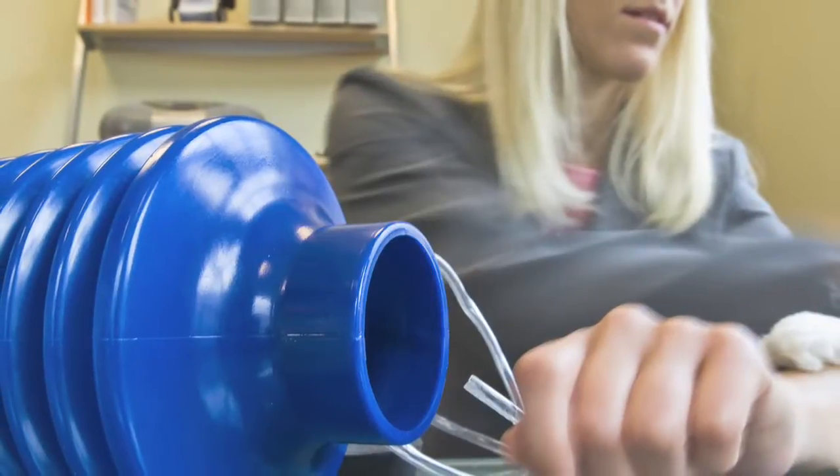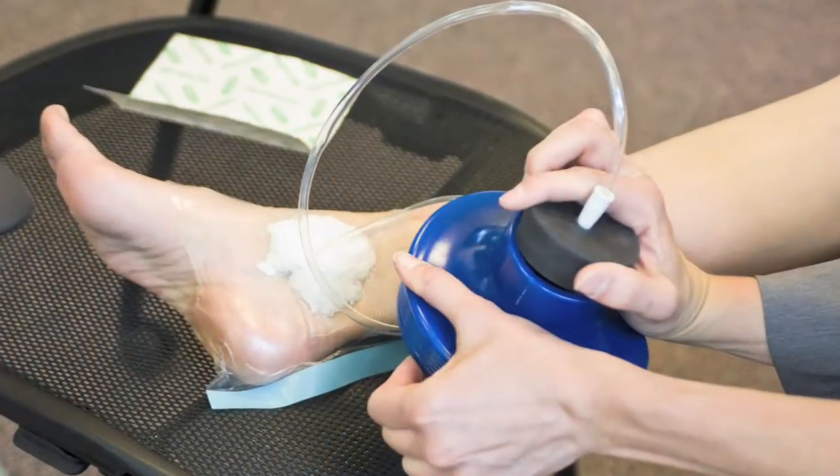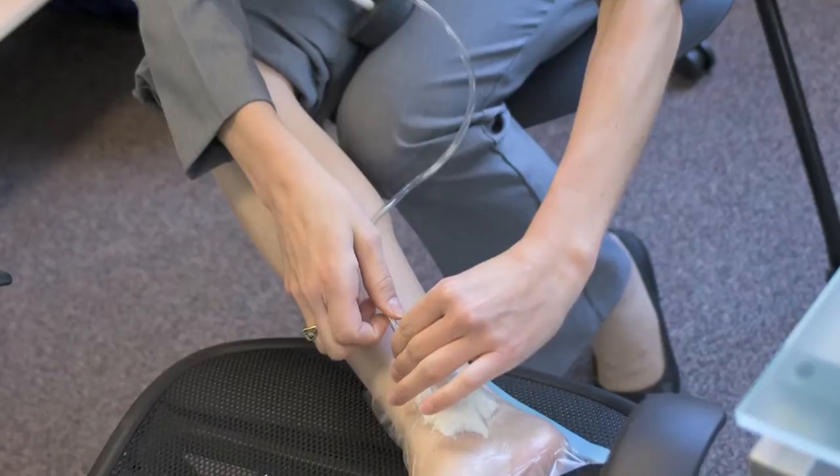I'm Danielle Zurochik, a PhD candidate in mechanical engineering at MIT, and I designed a simplified negative pressure wound therapy device for wounds in the third world. Specifically, we went to Haiti during the disaster relief effort to apply the device to applicable wounds.